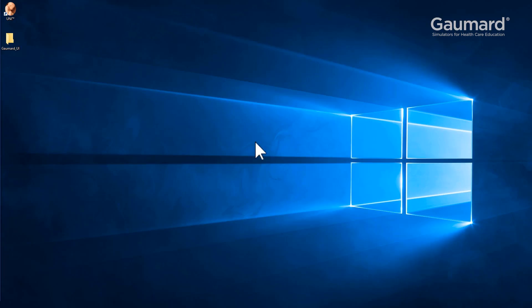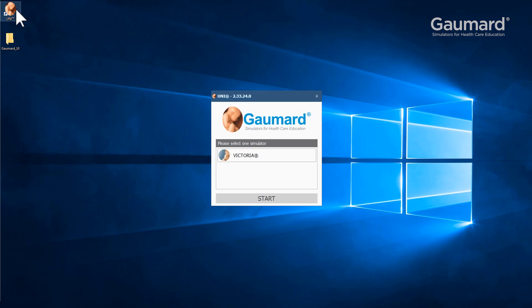Once the tablet is on, use the tracking pad or touch the screen to double-click the Uni icon. The simulator menu allows you to choose from all the simulators programmed to this tablet.